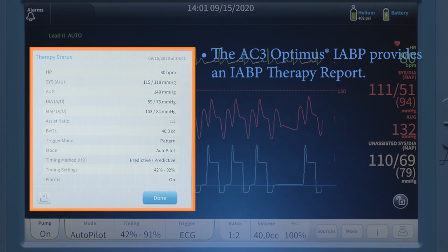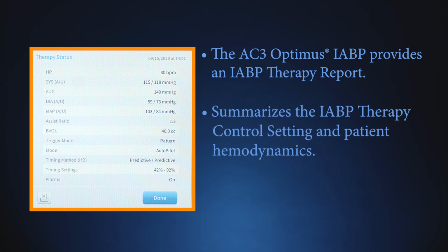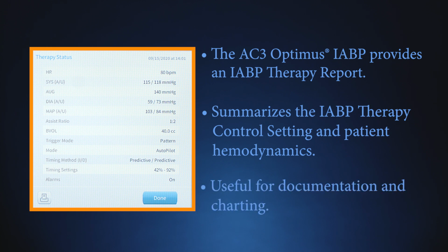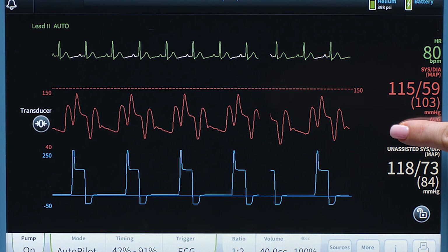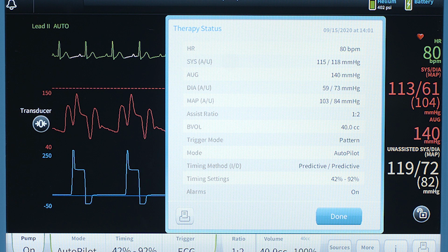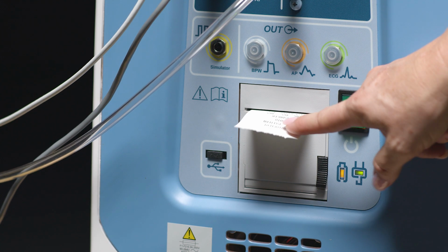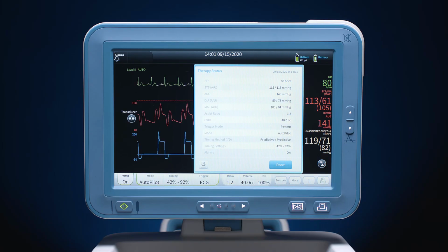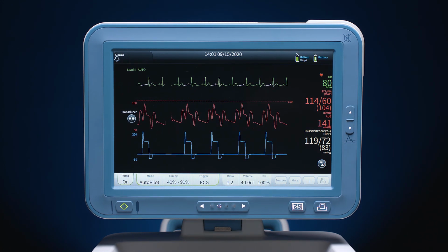The AC3 Optimus IABP provides an IABP therapy report which summarizes the IABP therapy control setting and the patient hemodynamics. This report may be useful for documentation and charting. By touching the display in the hemodynamic area on the screen, the therapy status report displays. To print this page, press the printer icon button in the lower left corner of the menu display. To close the menu, press the Done key or wait 30 seconds and the menu will close automatically.